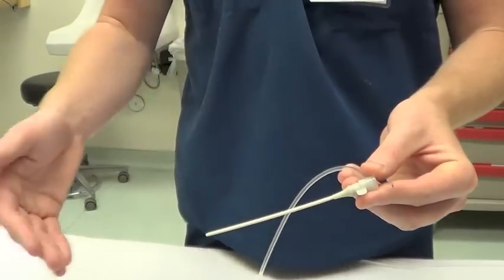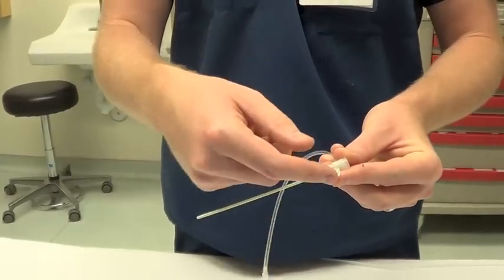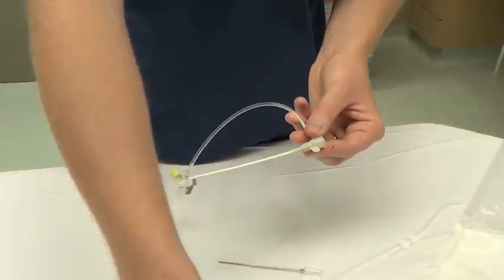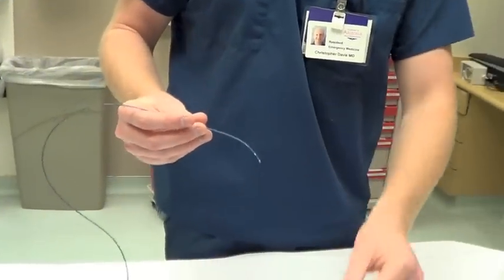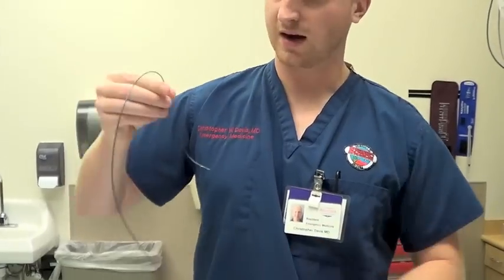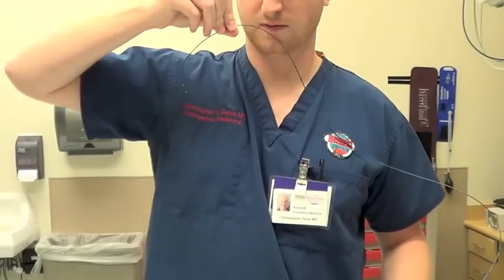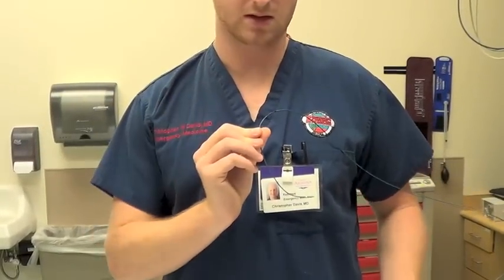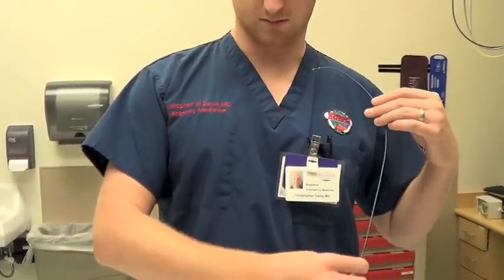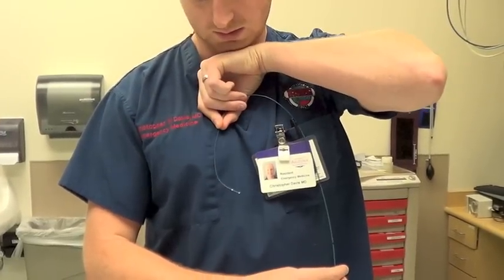What you're left with is your five French cordis now placed with your aspiration port. Suture it in place with the loop and you're ready to put your pacemaker in. One thing to remember: this wire has memory. If you're putting this in via the right IJ, you need to angle it so the wire can go into the heart — facing to the patient's left so it can make that curve. Going through the subclavian, it's the exact opposite — you want it toward the right to make the pass into the right atrium and down into the right ventricle.